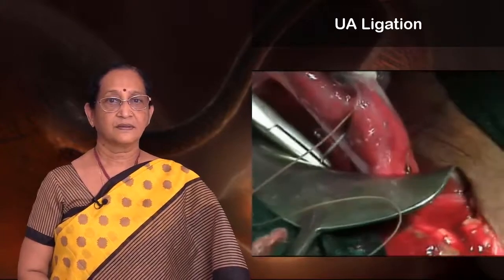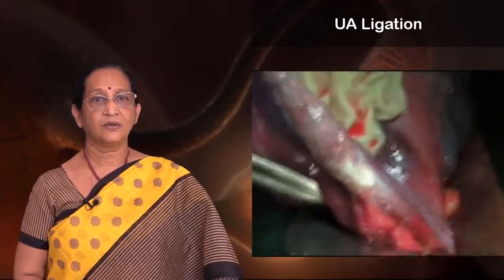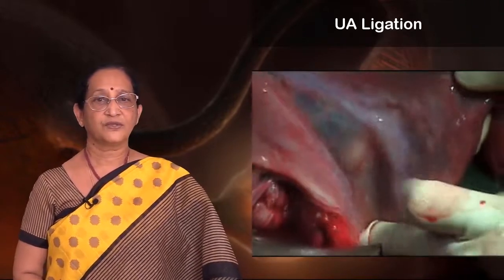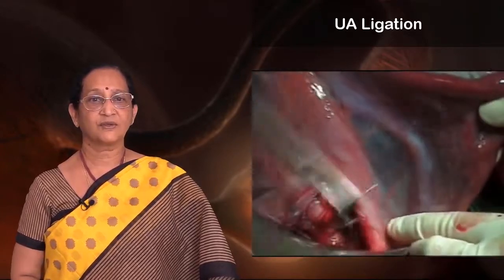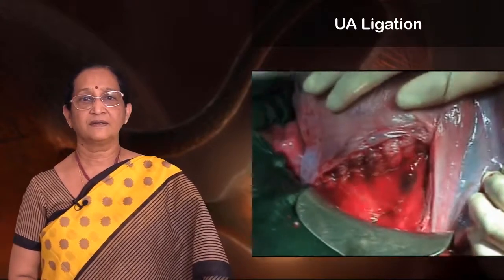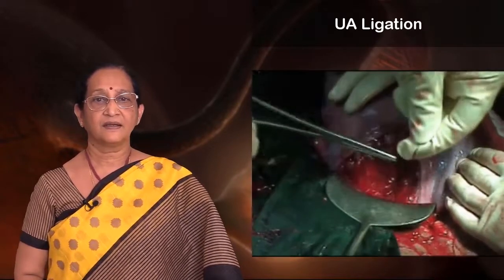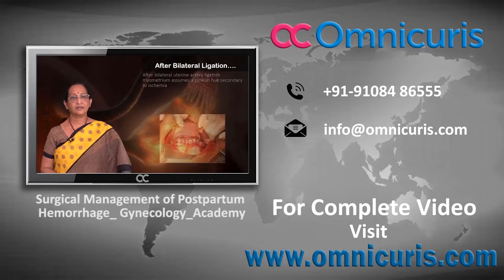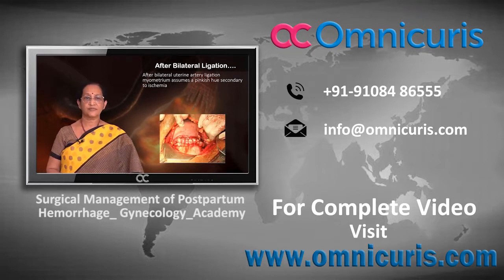This is the video for the uterine artery ligation. That's the uterine artery — the needle goes through and through, comes out posteriorly, and then again it is brought through the avascular area in front. You can see the elevated uterine artery which is ligated. It runs along the border of the uterus, just below the angle. The same procedure is repeated on the opposite side. After bilateral uterine artery ligation, the myometrium assumes a pinkish hue secondary to ischemia.